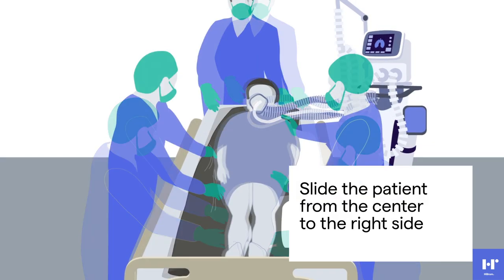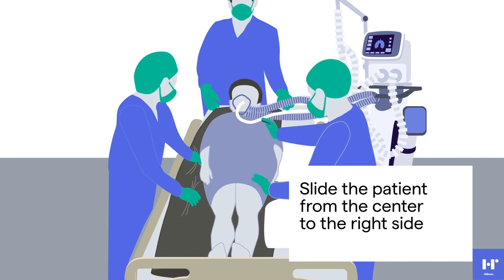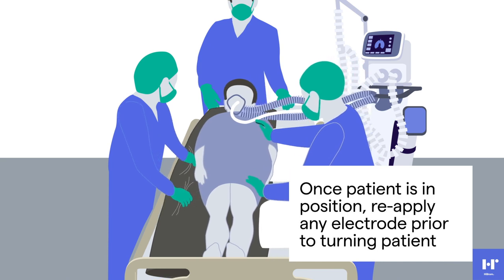On a count of three, the team will slide the patient from the center of the bed to the right side of the bed. Once the patient is in position at the side of the bed, the care team may reapply any electrodes that were in place prior to turning the patient to the prone position.